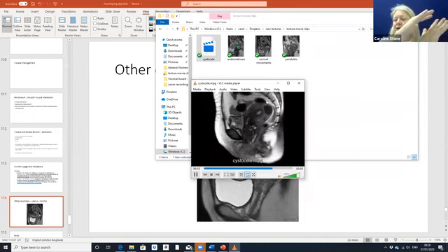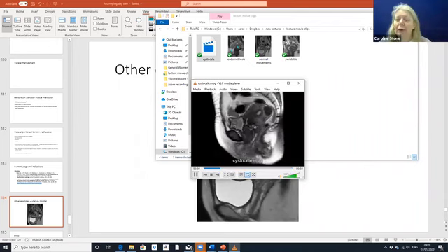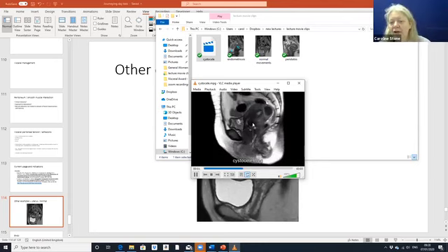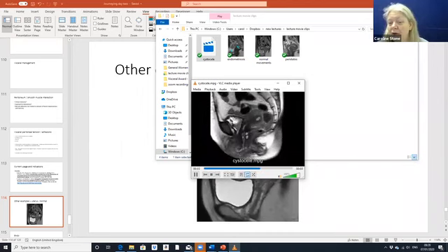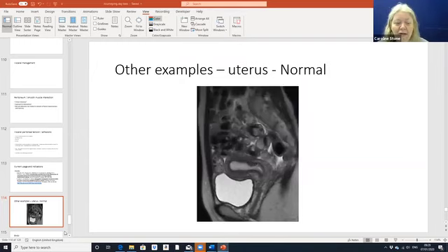But you can see that because this bladder is distorted, it has a funny shape. So again, mechanistically, it's not going to be performing appropriately. And as she does her Valsalva, this is her uterus, slight retroversion or slight verticality, and you can see that her vagina and the whole bulging is coming way below the level of the symphysis pubis as she does that. And you can see how all of the viscera are employed in that inferior displacement. So you can't just push it up and make it stay there, because all of these other cavity dynamics are clearly now compromising the whole dynamic. So there's a few little videos for you to hopefully set the scene on some stuff.